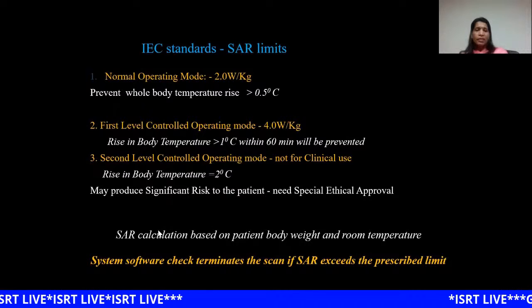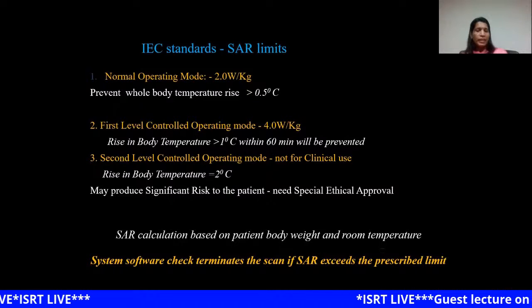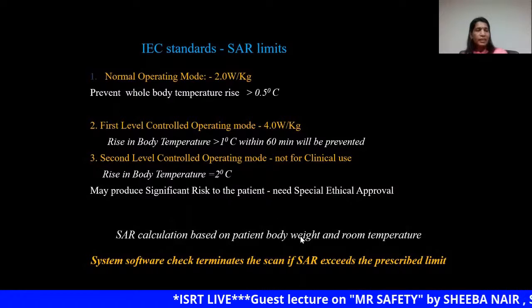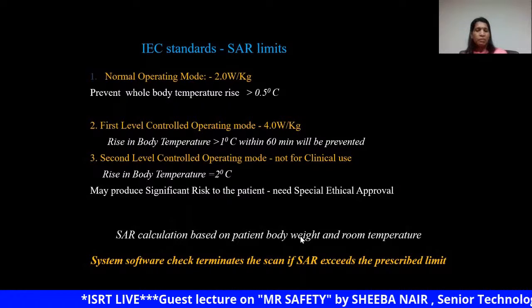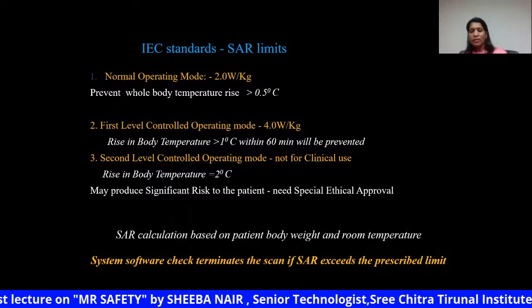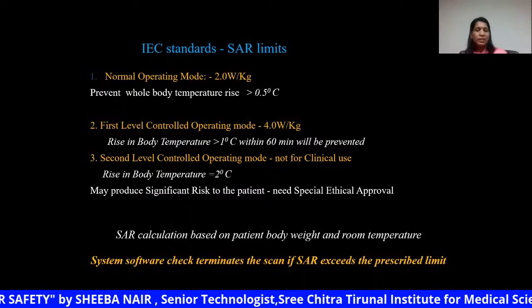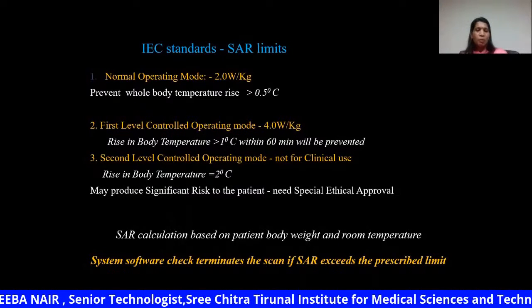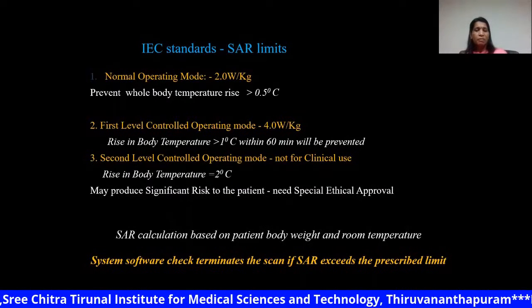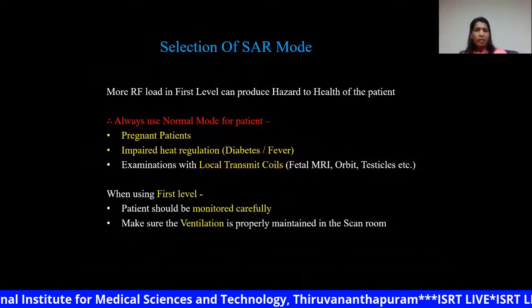And the SAR calculation is based on the body weight and the room temperature. So it is very, very important that while starting the scan, we enter the patient's body weight correctly. And also we should be alert to the system pop-ups. When the SAR limit is exceeded, the system pop-ups will come.